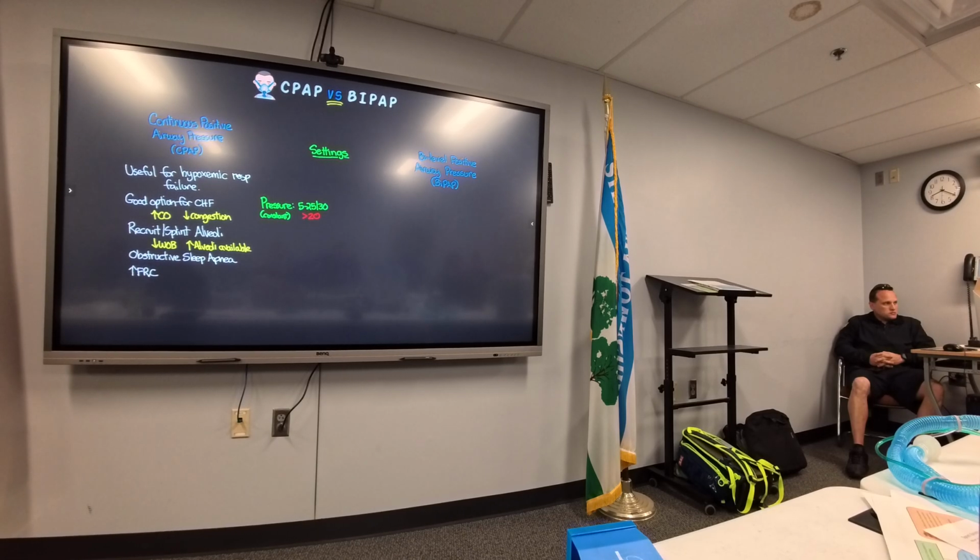All right, so let's go ahead and move on and talk about BiPAP. You may also hear this one referred to as bilevel or BPAP. These are all the same thing essentially. And BiPAP is going to be useful for our patients that have that hypercapnic respiratory failure or a combination of hypoxemic and hypercapnic failure. So this is going to be a good option for patients with COPD as well as our patients with heart failure.